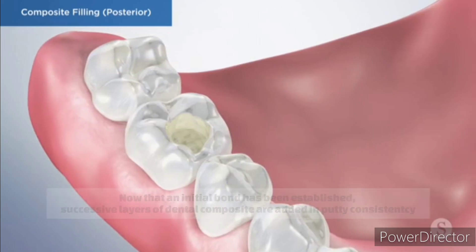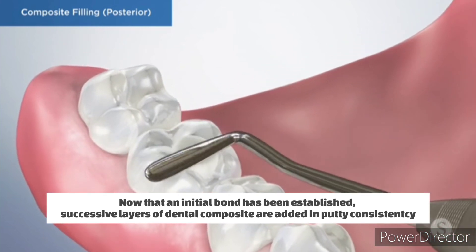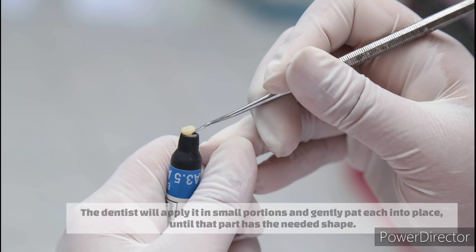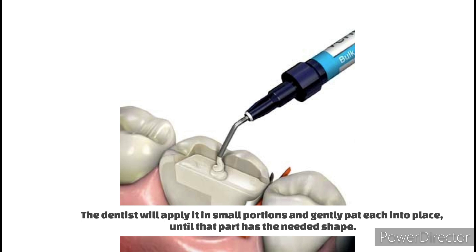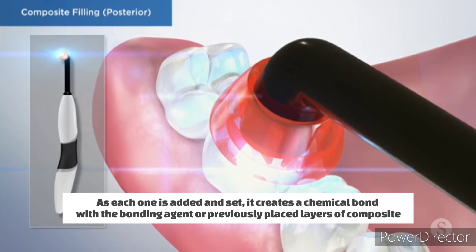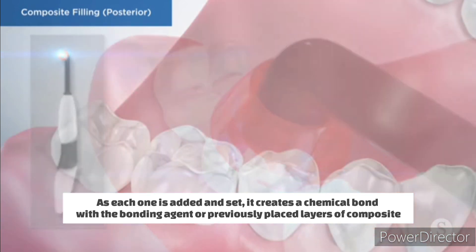Placing the composite: now that an initial bond has been established, successive layers of dental composite are added in putty consistency. The dentist applies it in small portions and gently pats each into place until that part has the needed shape. As each layer is added and set by the curing light, it creates a chemical bond with the bonding agent or previously placed layers of composite.